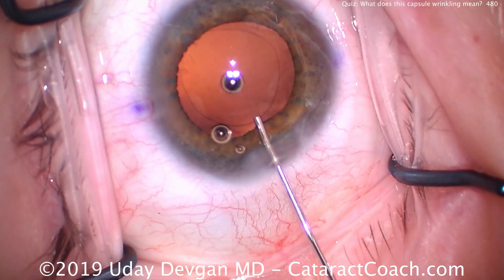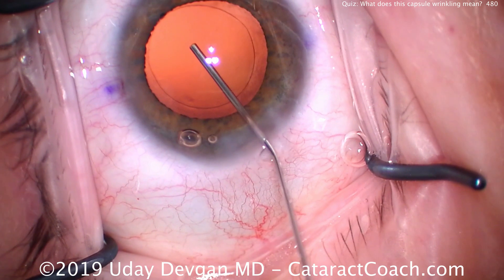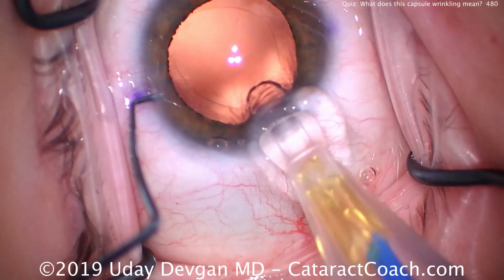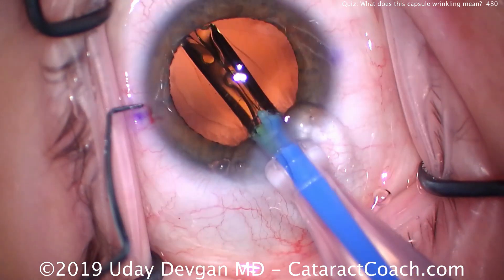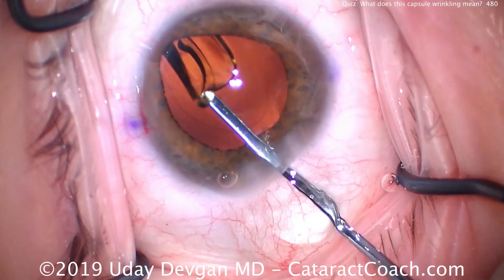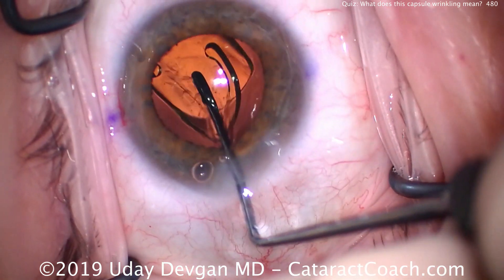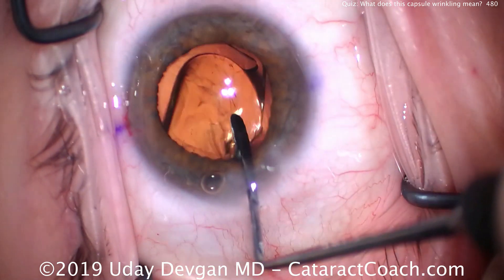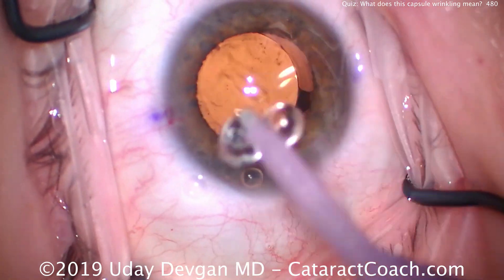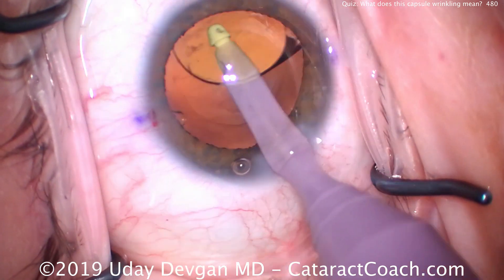This patient is relatively elderly, so we're less worried about long-term outcomes 10 or 20 years out — we're more concerned with her outcome now and her visual results in the next few years. We're delivering the lens into the capsular bag here, going without the capsular tension ring. We're going to make sure to clean up the anterior capsular rim undersurface, as previous studies have shown that cleaning the rim up may play a role in capsule contraction.